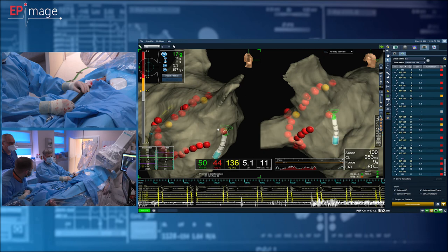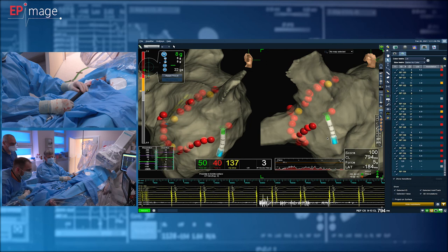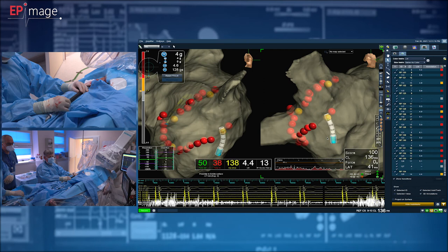So again, showing in real time, an application with 50 watts. All the applications, of course, were done with 50 watts, as you noticed, but sometimes we speed up the recording just to shorten the presentation time.